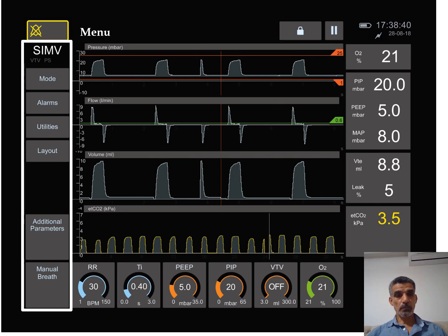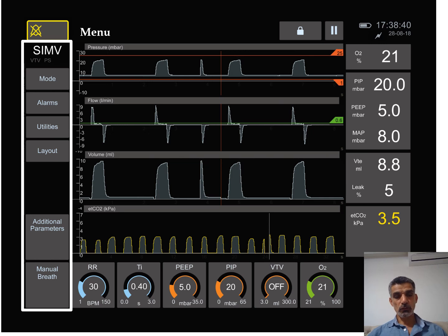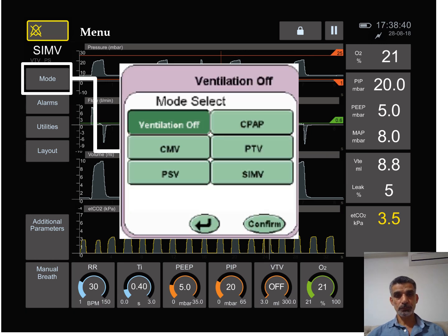We have also the menu which tells us the other features like the mode, the alarm, other utility and layout, and also if we can give additional parameters or manual breath. It's actually different in different ventilators.